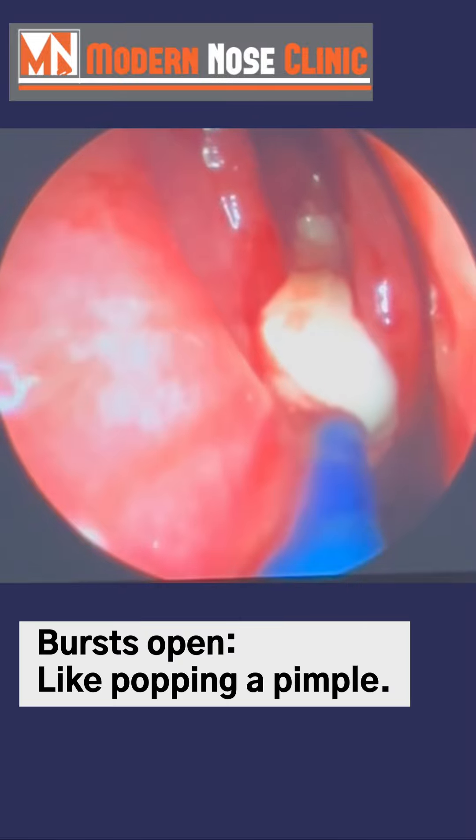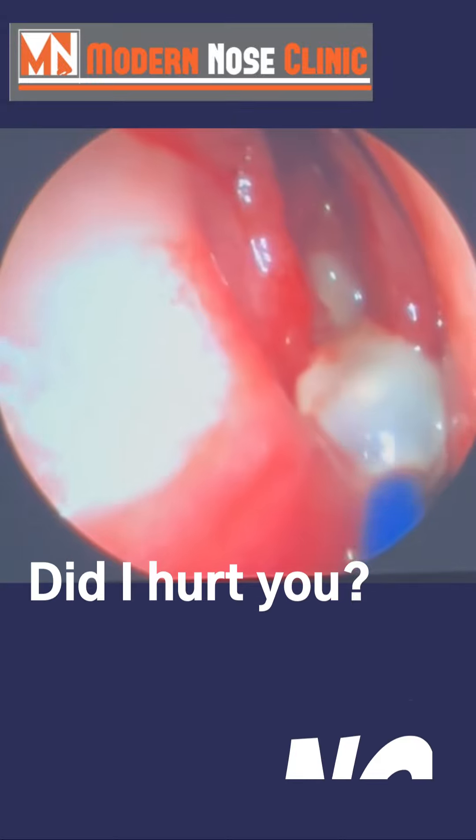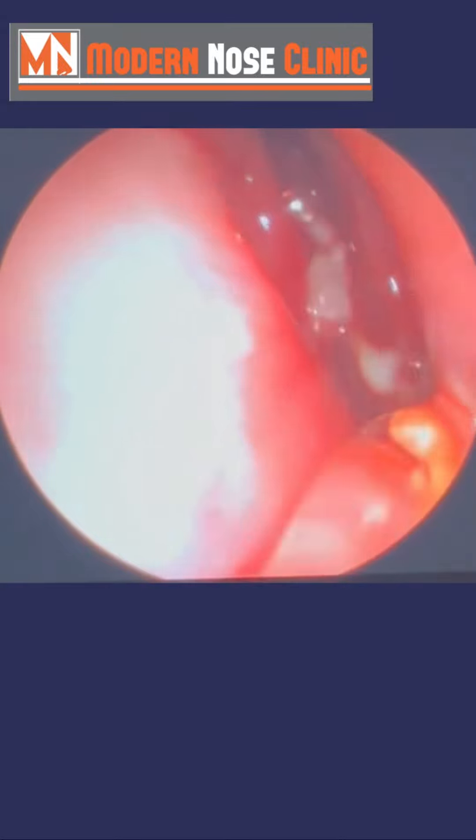It's like popping a pimple, just like I told you guys. Of course we don't want to swallow that. Did I hurt you when I did that? She says no. You guys don't have to be scared. It's going to be okay.